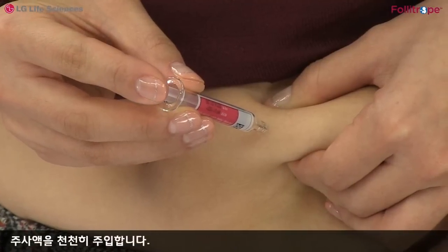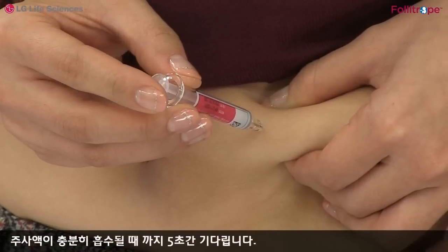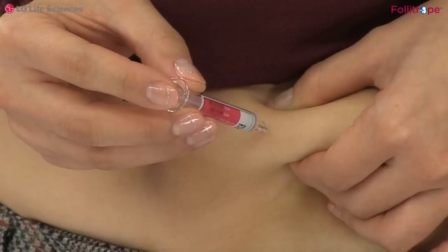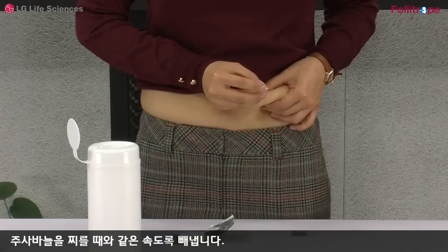주사액을 천천히 주입합니다. 주사액이 충분히 흡수될 때까지 5초간 기다립니다. 주사 바늘을 찌를 때와 같은 속도로 빼냅니다.